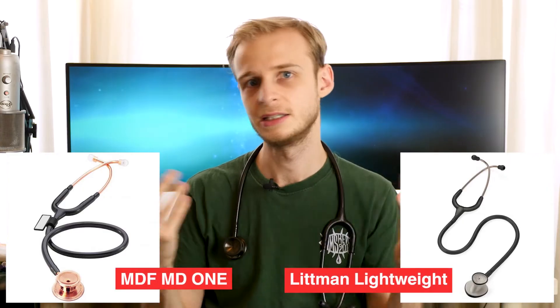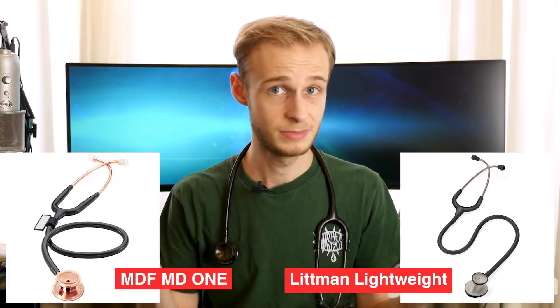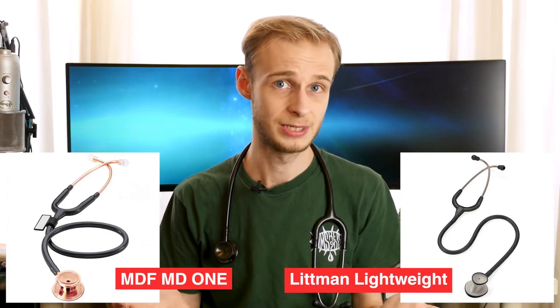However, if you're looking for something a little more budget — closer to the £50 mark — then from the research I've been able to do, either the MDF MD-1 or the Littmann Lightweight series seem to be really good reputable choices. MDF and Littmann both have a really good reputation in the stethoscope market, and they'll let you do all the things you need to be able to do as a medical student.